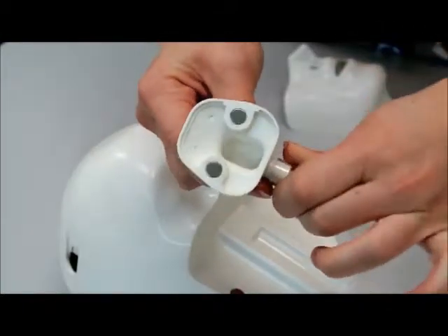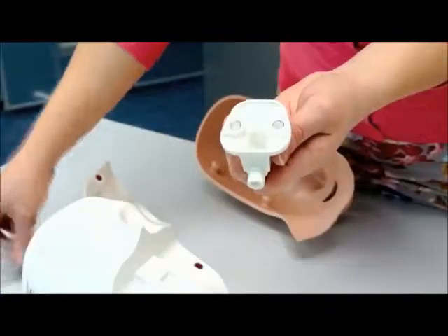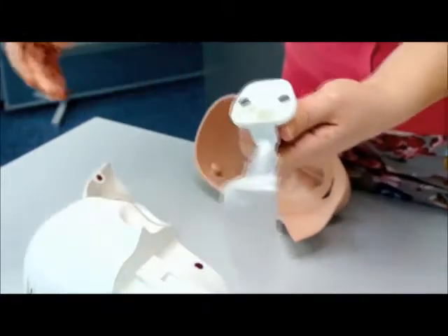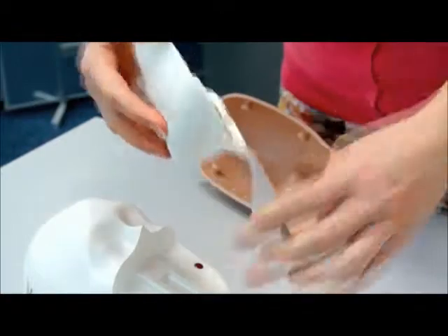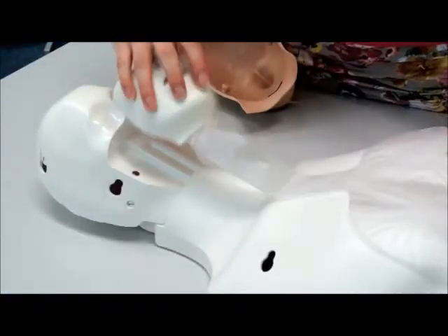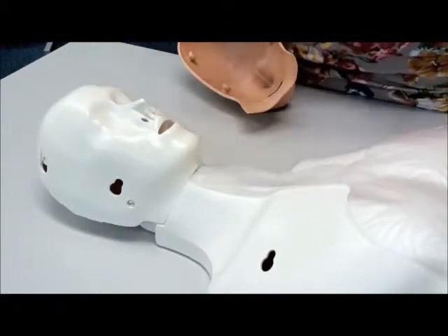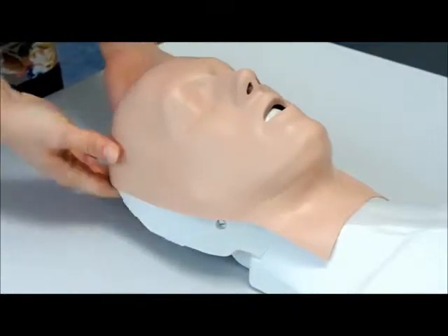Replace the used lung bag with a new one, and reattach the lung bag socket to the jaw insert. Make sure that the lung bag lays flat once in place. The face and thorax skin should then be reattached.